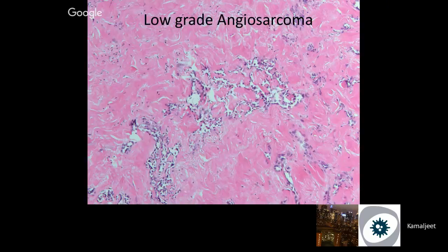More pictures, very dissecting through the collagen, and it may look very bland. But what would help in both is the history. The patient had a history of lumpectomy with radiation, and now she presents with vague fullness involving the skin after 3 to 4 years.